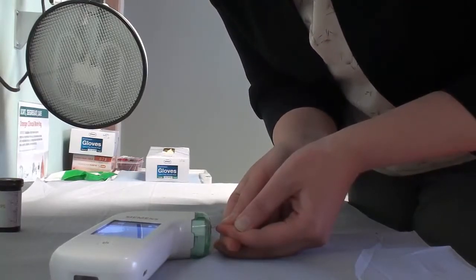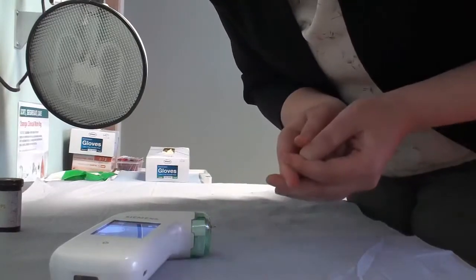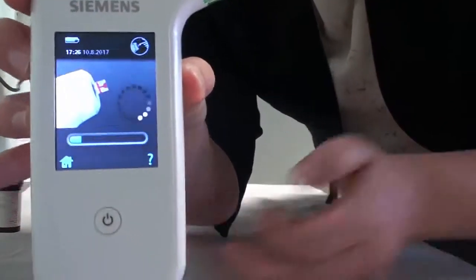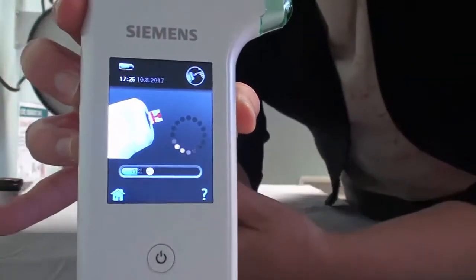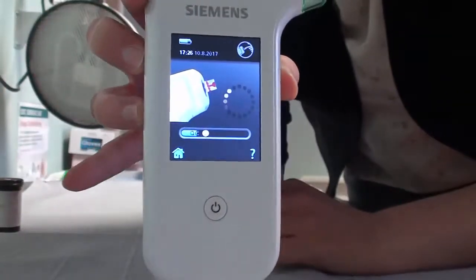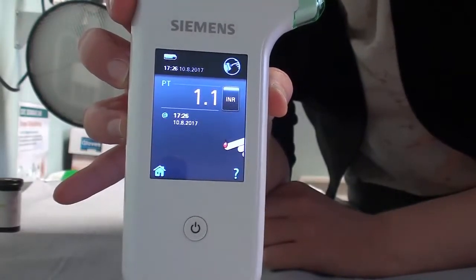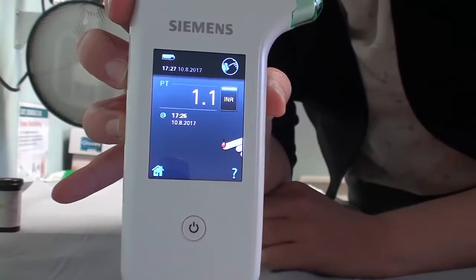Hold your finger there for one second until the bar comes up showing that it's processing down at the bottom. And there you go — I have an INR of 1.1.